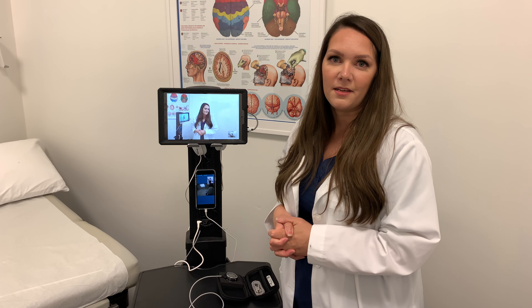You don't have to have this plugged in while you're in the room with the patient — it is battery operated. However, it is very important that whenever the visit is completed, you put everything back together in its place and make sure it's plugged into the wall so it is charged for the next time that you go to use it.